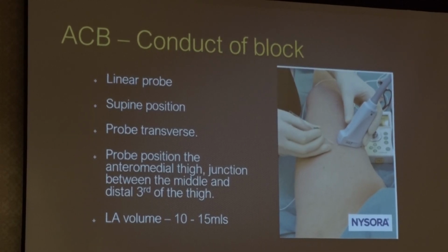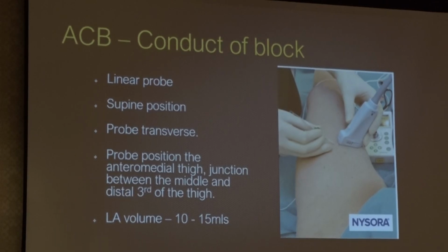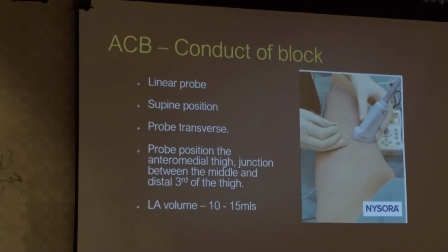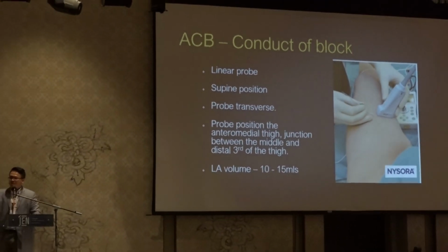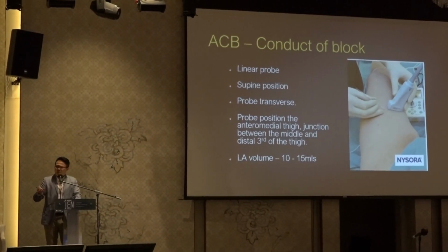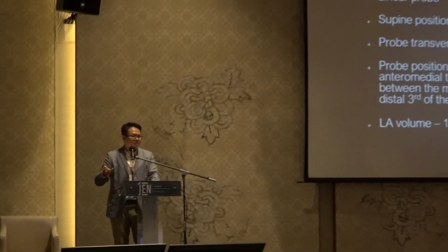I was thinking, what pain? Maybe it's the best time for me to try out this adductor canal block. So it's after the surgery, the patient was in recovery. So I did an adductor canal block. Fifi was there to help me. We injected quite a bit of local anesthetic, about 30 to 40 mils, and the pain score went from 8 to 2, which is good, right? Okay, that was the first time I did it.